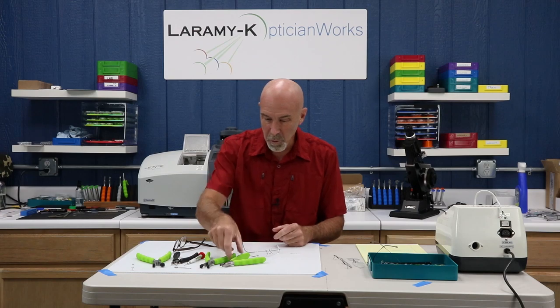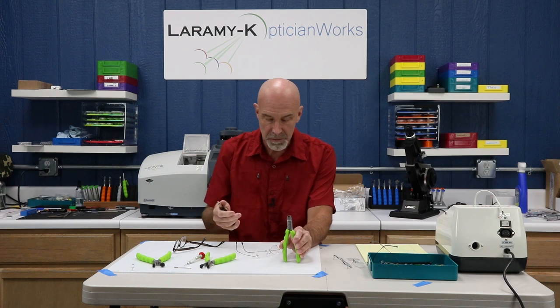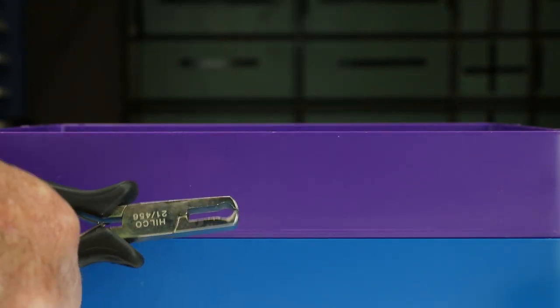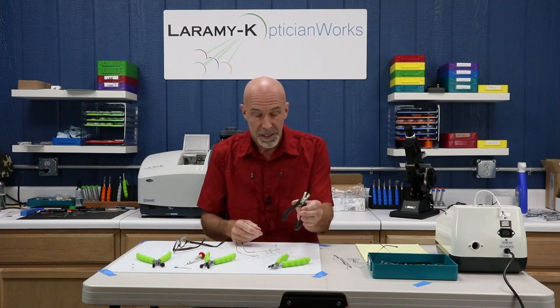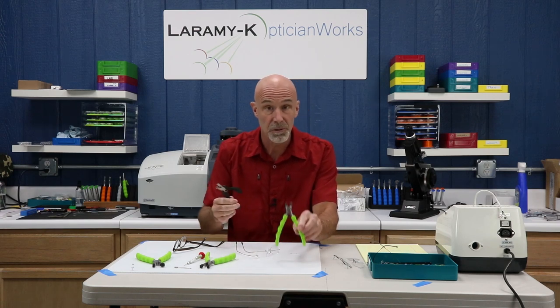Let's go over tools. You want two pairs of snips — one pair to keep for any time it's coming in contact with the lens when putting things back together, and the other one you'll use to nibble the bushings off any posts. After you snip and pull them apart, there will be some leftover on the barbed style that you need to trim away. If you have two of the same pair, put a piece of tape on one so you can tell them apart.